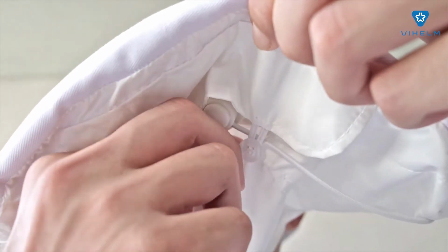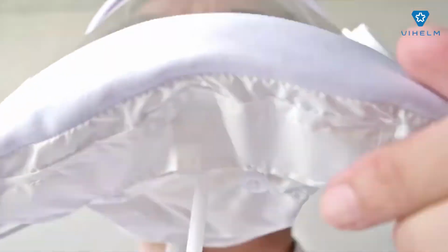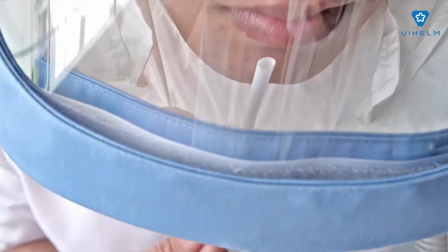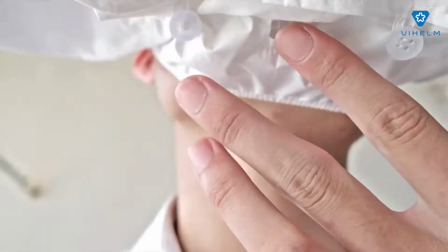Step 2. Wash hands with soap or sanitizer. Put a clean drinking straw into the drinking straws valve. Step 3. After taking off the drinking straw, make sure the valve is completely closed.